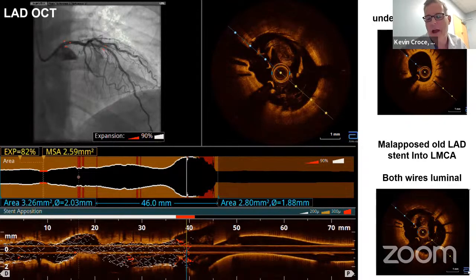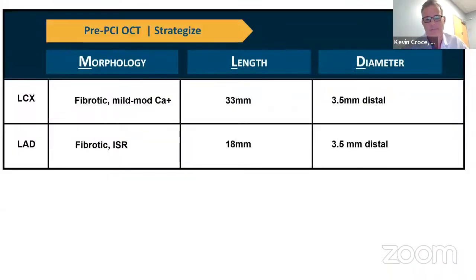And then a little bit of bearing in terms of, with a pile of metal in the left main already, DK crush or culotte was something that we spoke about. Any thoughts from the panel? I don't know, ever since Margaret's been at Columbia, we've been flipping from DK crush to more and more culotte. So I'm going to err and say culotte on this one.